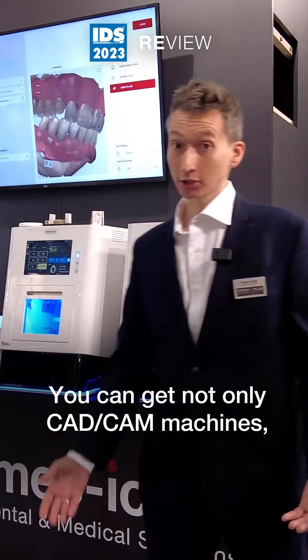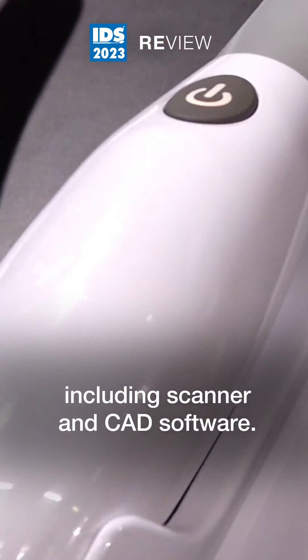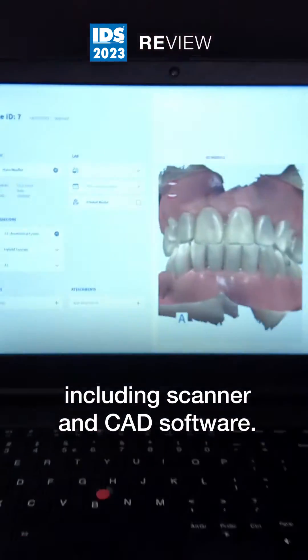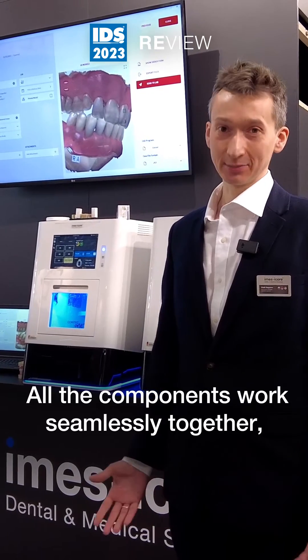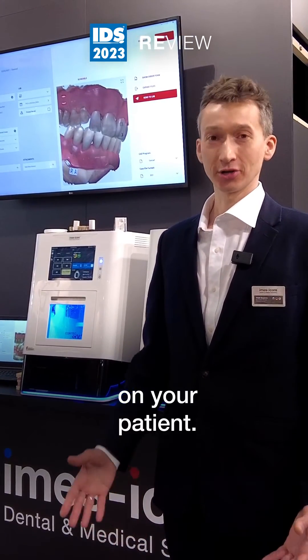You can get not only CAD CAM machines — you get the complete workflow from us including scanner and CAD software. All the components work seamlessly together so that you could concentrate on the main part: on your patient.